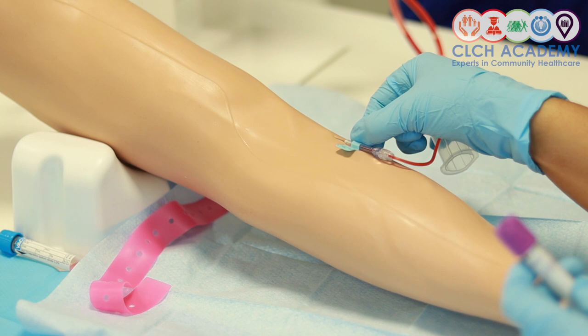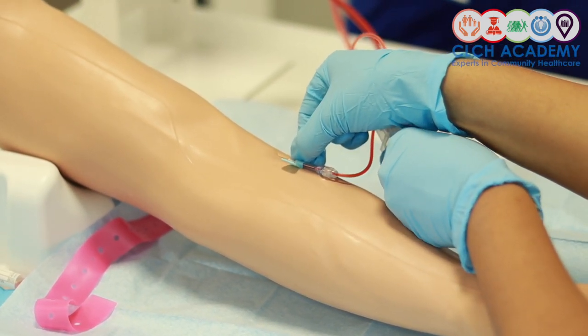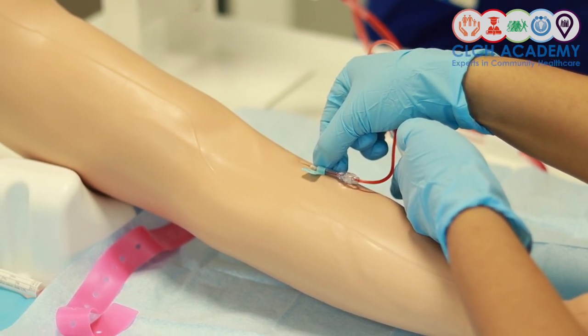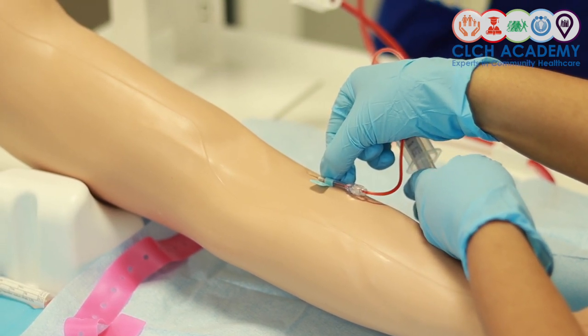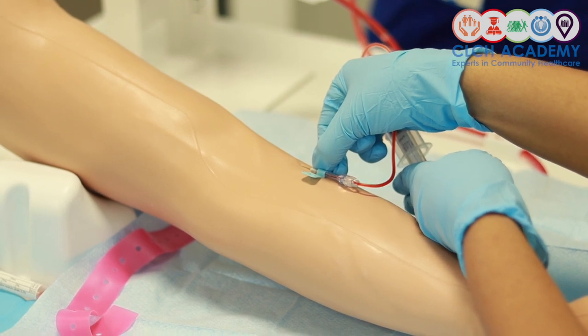My last bottle in the order of draw for this is the group and save. Collecting the sample. Getting that to fill up. And that recommended limit for this one is about 4 mils. I'm trying to make sure I get to about 4 mils for the bottle.